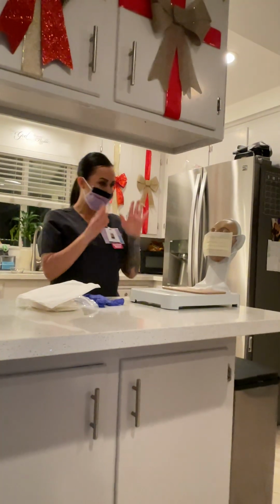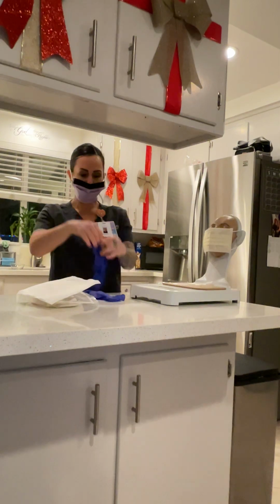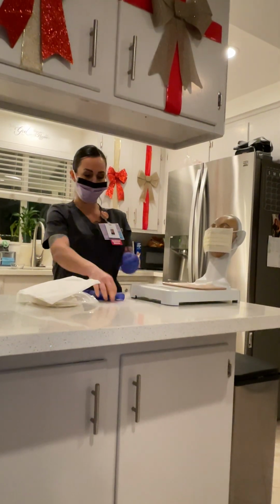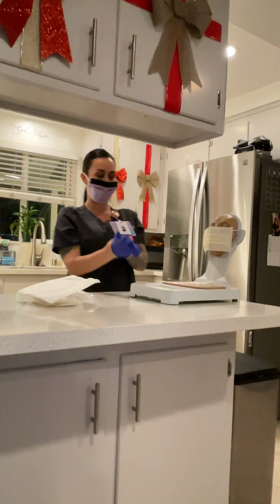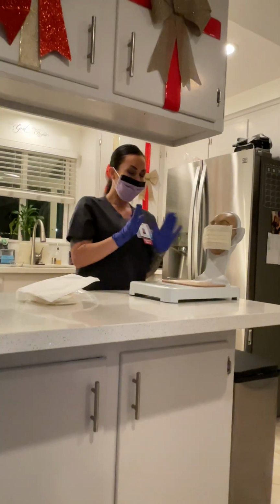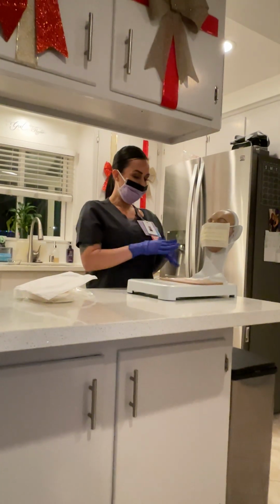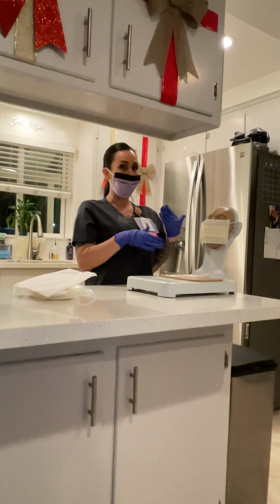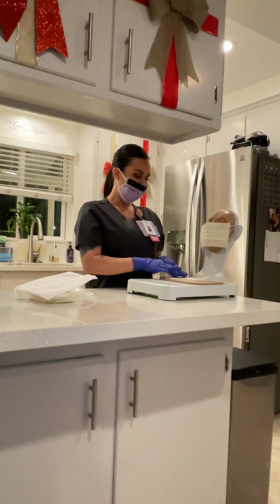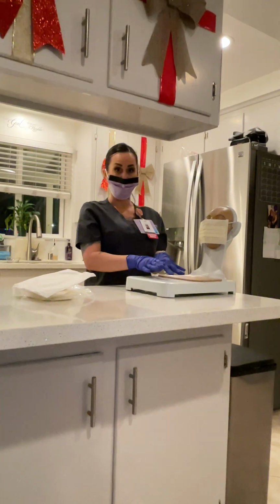All right, so now that I have the mask on, I'm going to perform hand hygiene. All right, I am going to place on my gloves. And at this time, I am going to look around the insertion area. I want to palpate the site just to make sure that there isn't any tenderness, as well as any signs of maybe some fluid or any sub-Q fluid around it. So we're just doing some palpating here and some looking around.